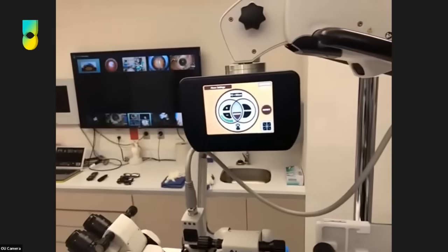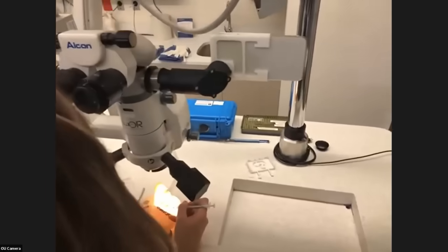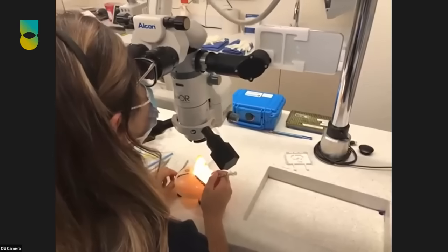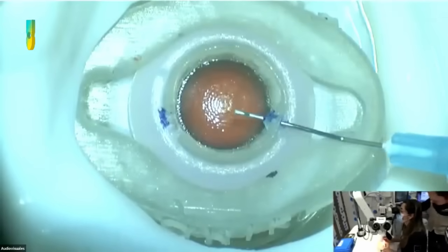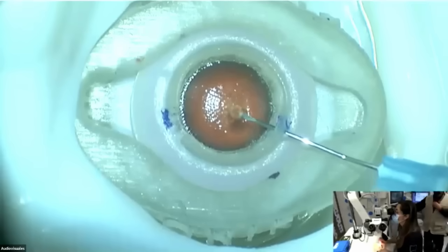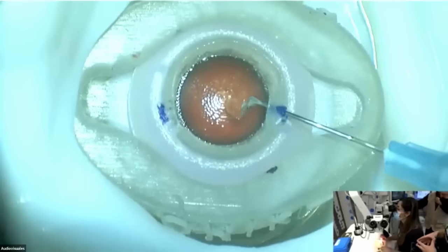Let's see if we can see this signal with the hands of Marcela, who's our student. So please, let's start doing that capsulorhexis. So as you can see there, she already has the incision. We have two ways to do it, right? In this case, we don't have a cornea because what we want is to talk about all the components that are involved in a capsulorhexis.